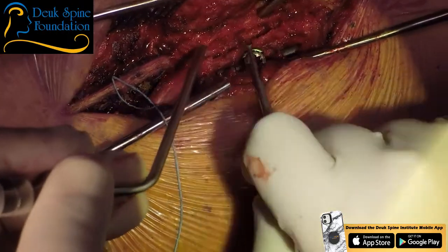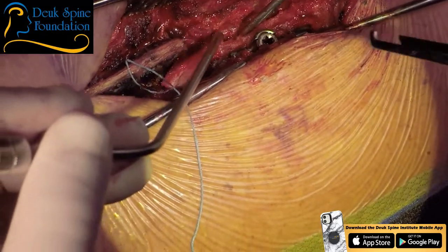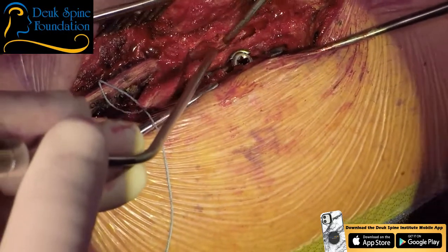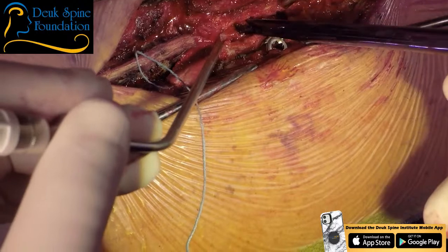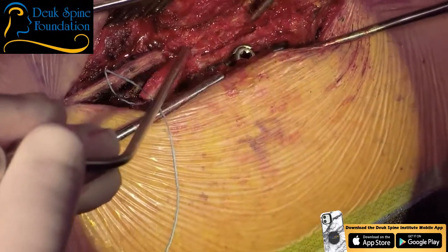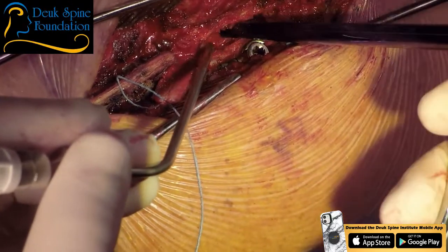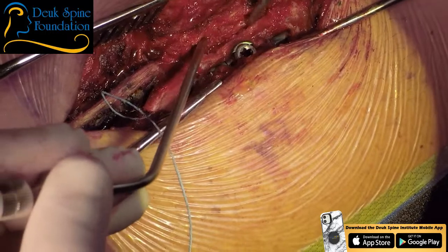Just about done. Let me have a Kerrison 3. That's just the last of that ligament right there off to the side that we want to get rid of. And we're going to be closing. Do you have suture to close? And we have the bone graft? We have bone graft. Give me one second and I will. Take your time.